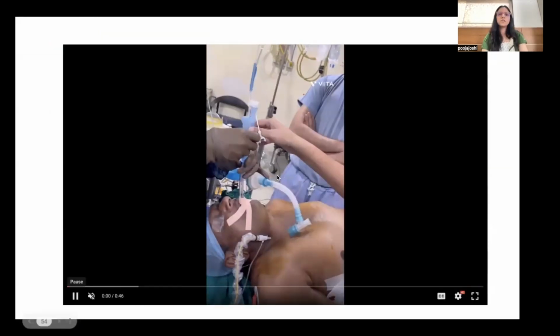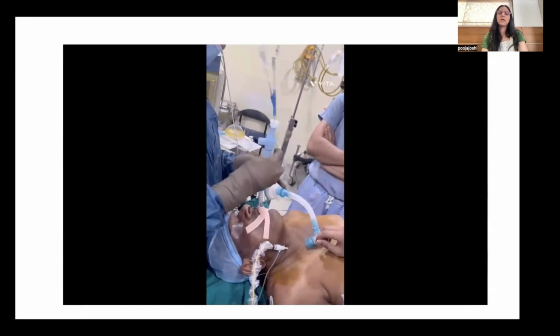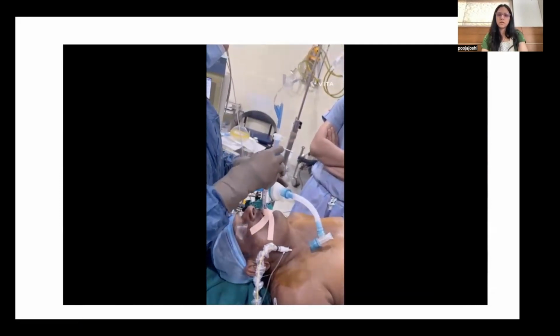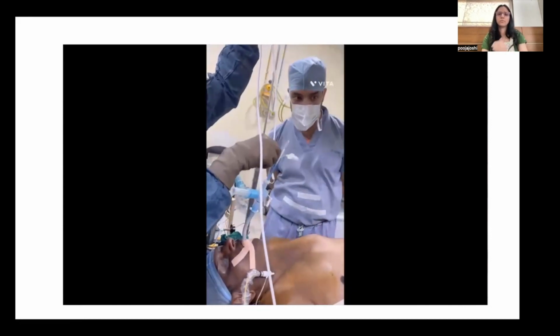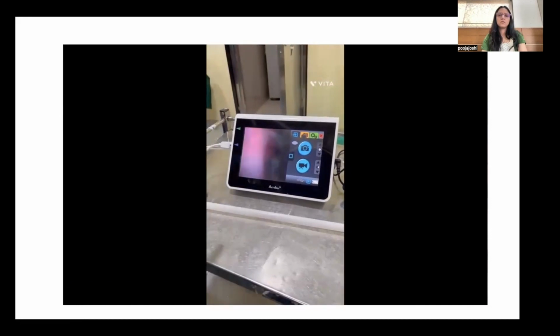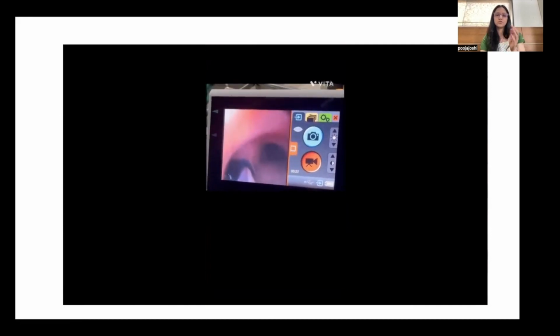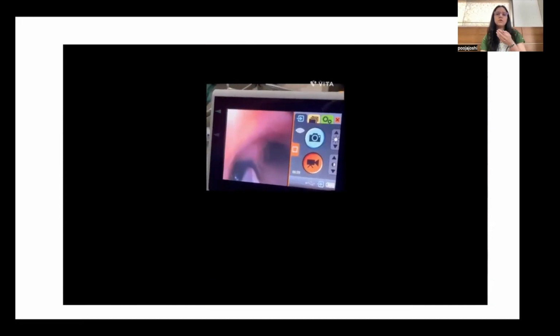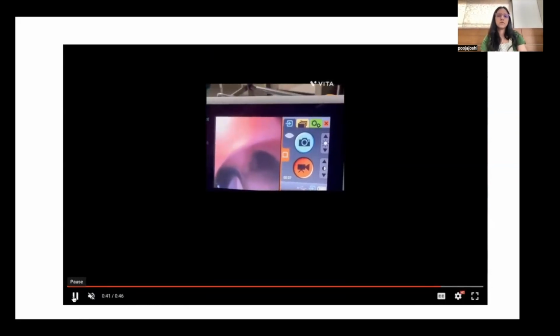Also, you can initially insert the Coopdech blocker blindly, and then you can ventilate the lung, and after that you can pass the fiber optic bronchoscope to optimally position the cuff inside the left side. The position of the cuff should be noted. It should not herniate into the carina. It should be optimally inside the left mainstem bronchus, usually 5 mm below.